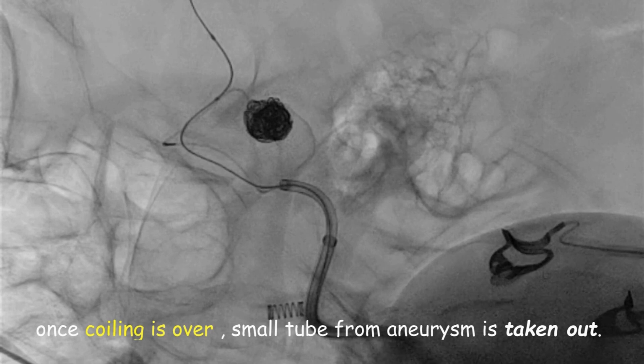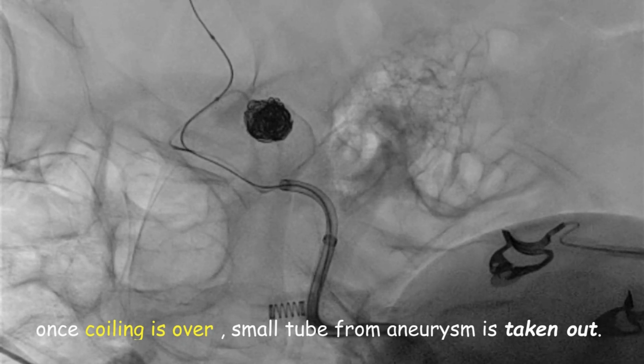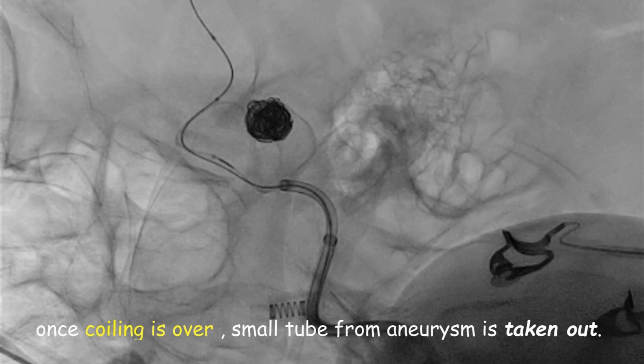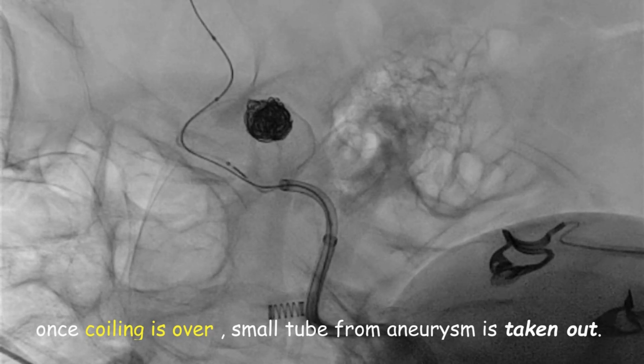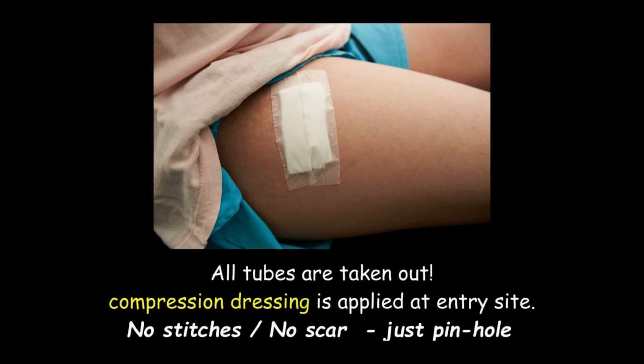Once you are satisfied that the coiling is adequate, you can take out the small tube from the aneurysm gently, so as not to disturb any coils. And finally, all tubes are taken out. A compression dressing is applied at the entry site. There are no stitches, no scar.